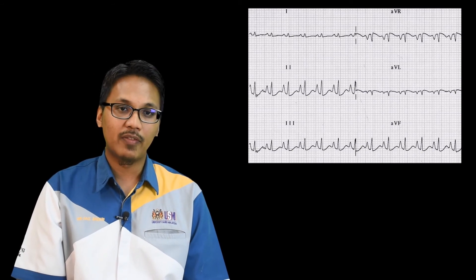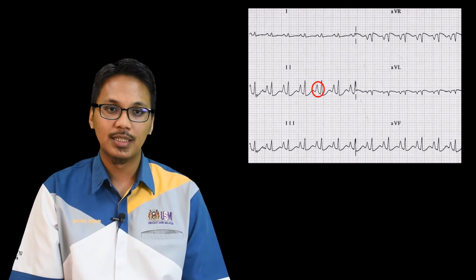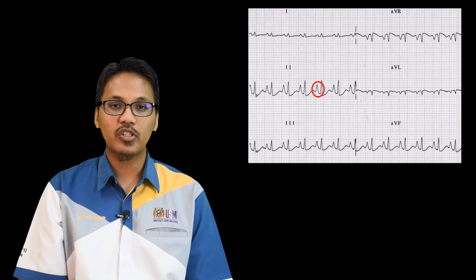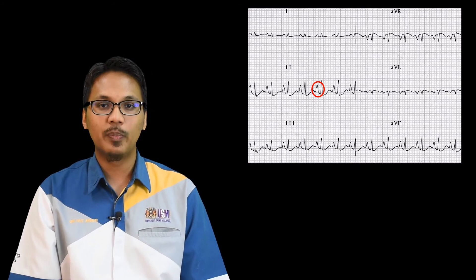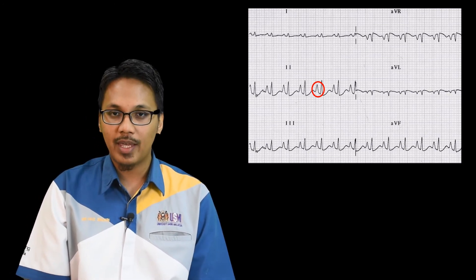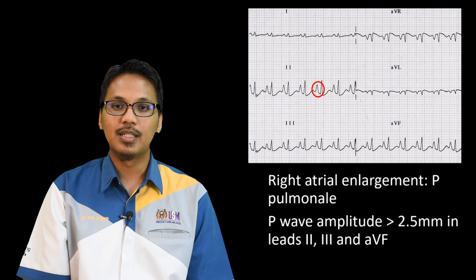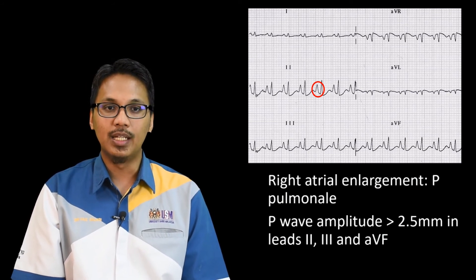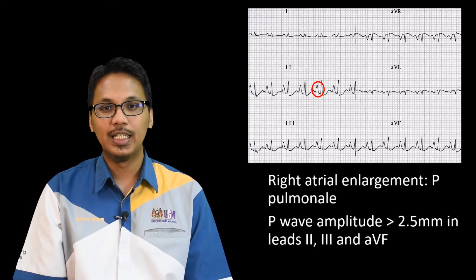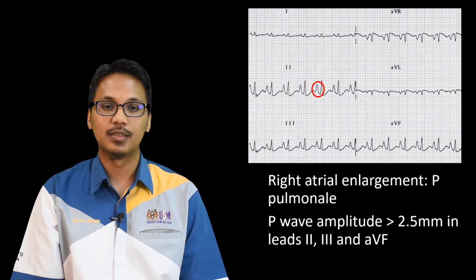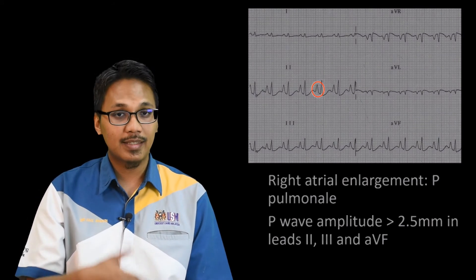As you can see from the red circle, there is an obvious large and peaked P-wave, which when measured is more than 2.5 mm in lead 2, lead 3, and lead AVF.